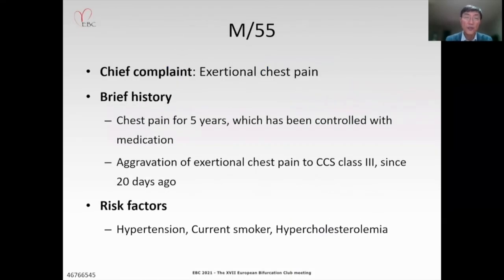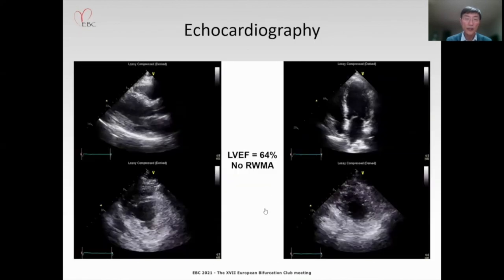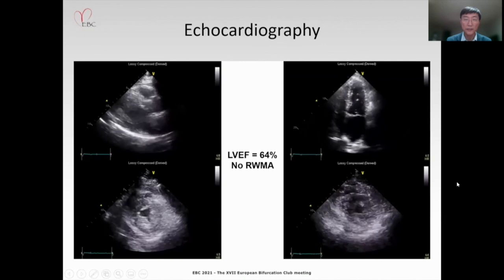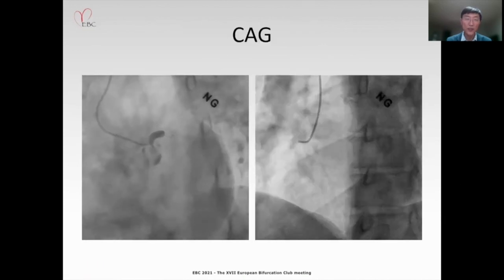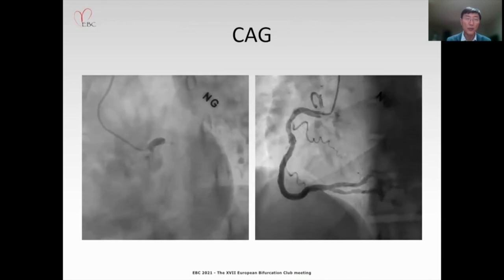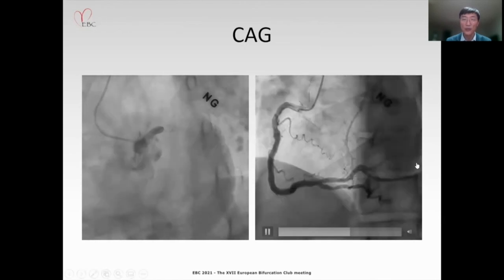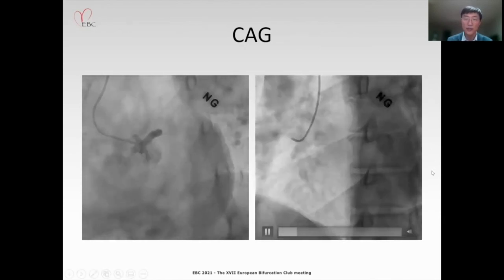This is a 55-year-old male patient who complained of exertional chest pain for 5 years, which had been controlled with medication. But it was aggravated to CCS class 3 since 20 days ago. He was hypertensive, a chronic smoker, and had hypercholesterolemia. The ejection fraction was normal, and there was no regional wall motion abnormality. But surprisingly, the first angiography of the left coronary artery showed a left main total occlusion, and the right coronary angiography showed abundant collateral circulation to the LAD and also the circumflex from the RCA.